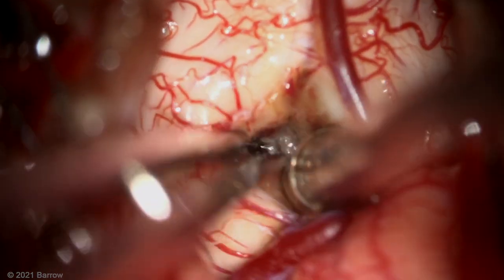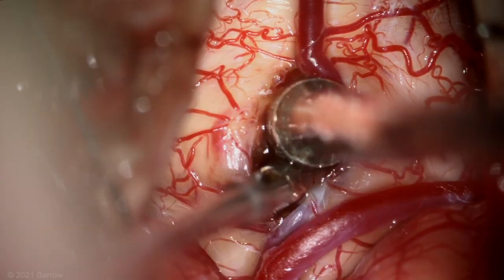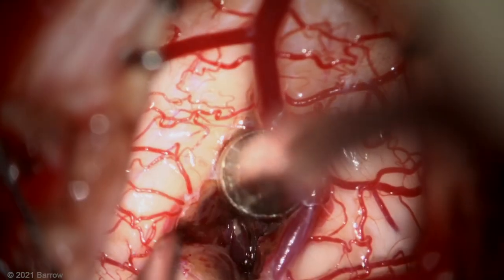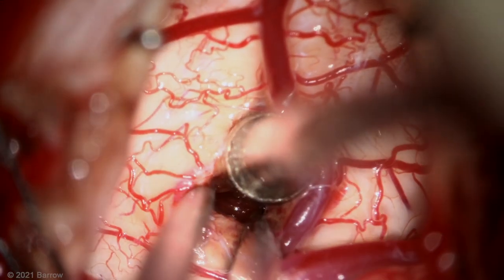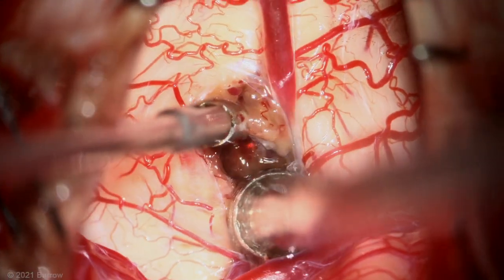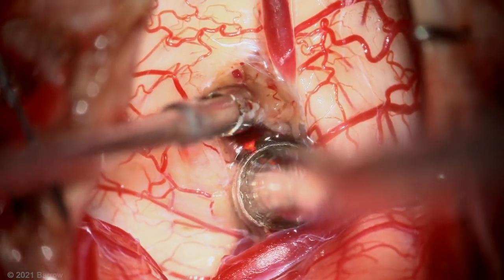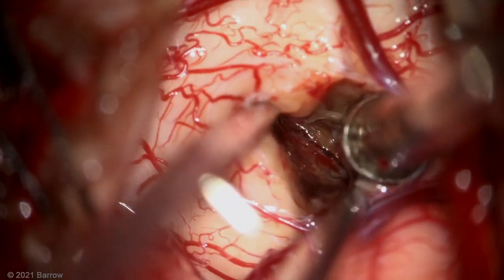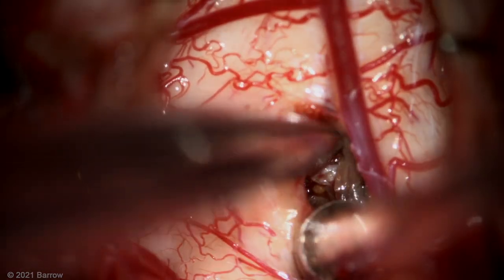This lesion was a little bit more adherent than expected. You can see that I'm using gentle traction to help identify where these points of adhesion are located, and here finally I can break into that plane and separate the capsule from the adjacent gliotic margin. There are some dense adhesions holding the malformation inferiorly, so with some additional work I can get around those points of adhesion and start to free it up.